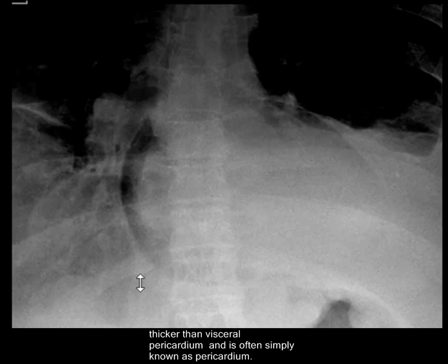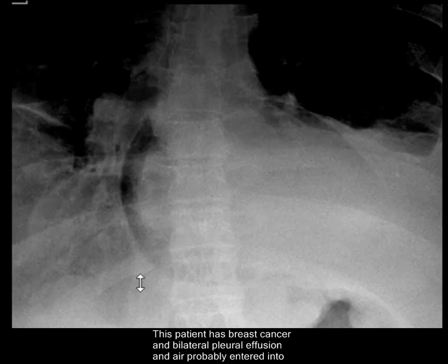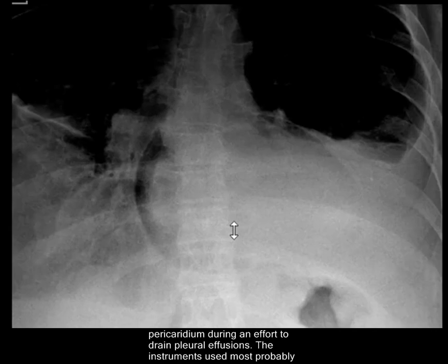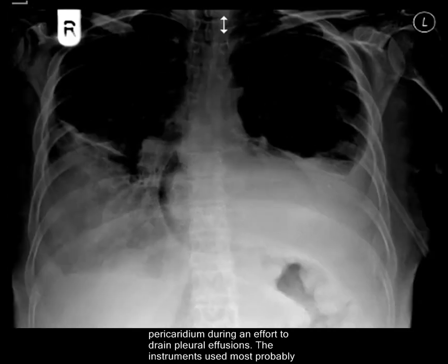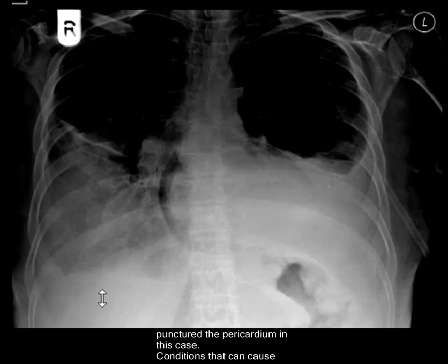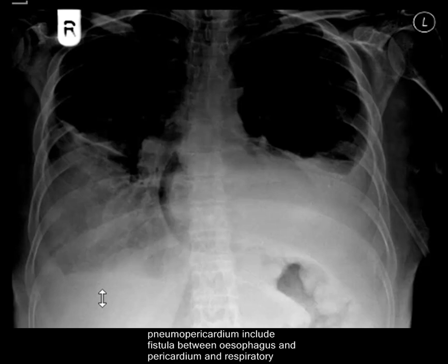The patient has breast cancer and bilateral pleural effusions. Air most probably entered into the pericardium during an effort to drain the pleural effusion, as the instruments used most probably punctured the pericardium. Conditions that can cause pneumopericardium include fistula between the esophagus and pericardium, and respiratory distress syndrome in children, among others.